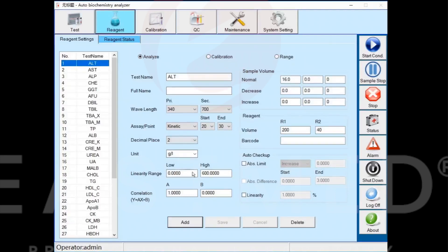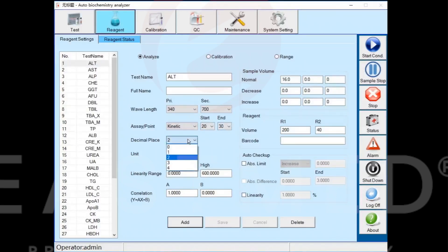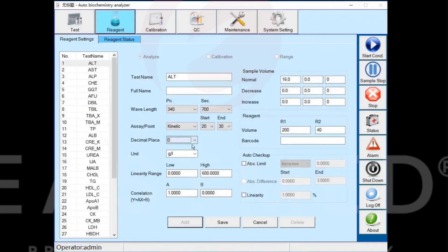Enter the name of the item, the wavelength, the test method, the read point, and so on. Click the save button to save.